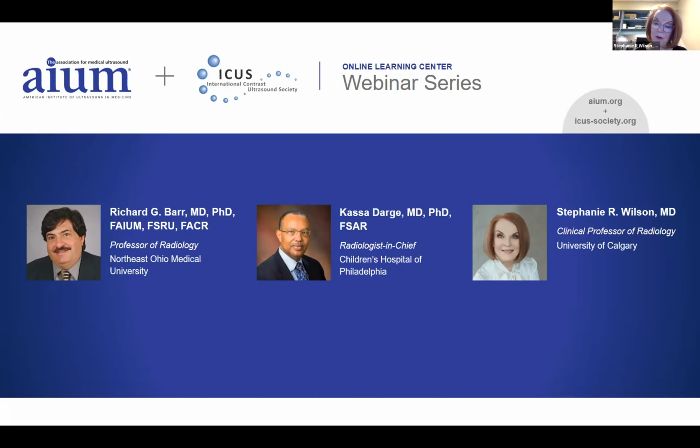Yeah, that's great, Richard. And I think that answer is terrific. I obviously have a different regulatory situation than any of you have. Our orders come for CEUS, so it's not a question of getting an additional order for CEUS. It's a question of using your discretion for whether you use the order or not. In pediatrics, it's the same as Dr. Barr explained.